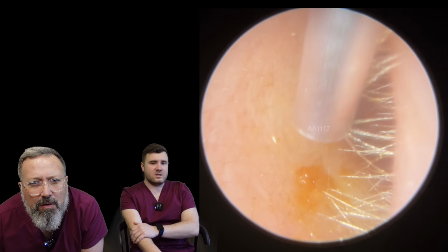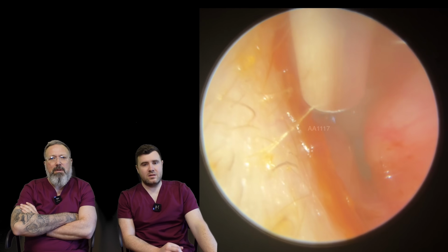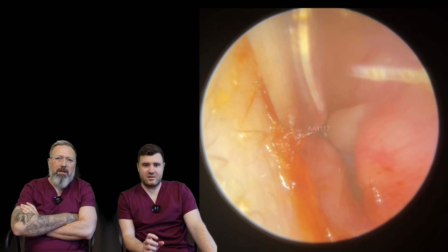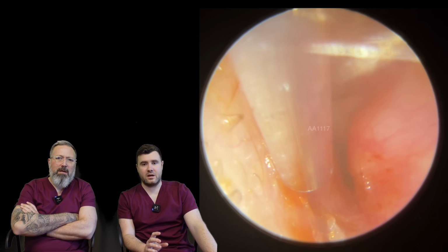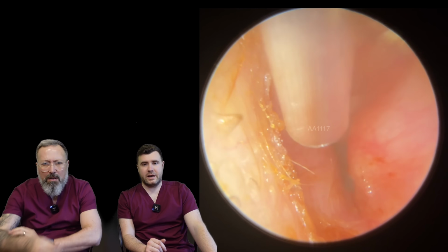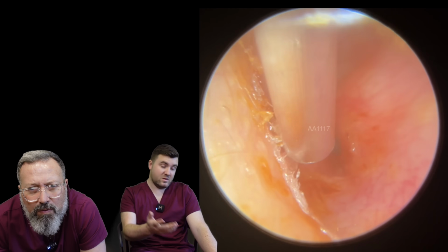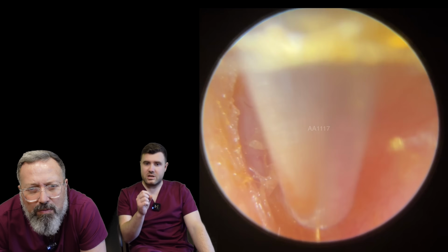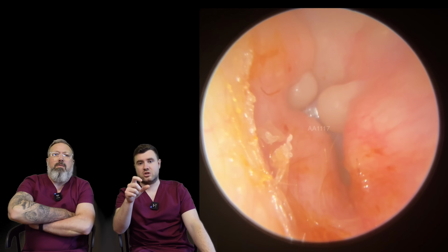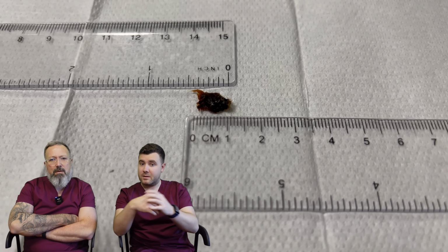Now, you can see a very, very small portion of the eardrum. This is on the cusp of referring the patient to get these looked at. But the patient's actually not in any discomfort at all. They said the hearing is absolutely fine at the moment. But we generally do tend to refer for this exostosis when it does occlude the eardrum and becomes uncomfortable.